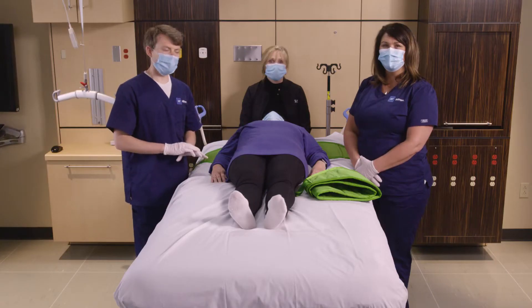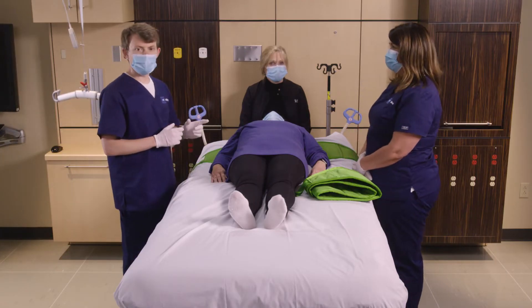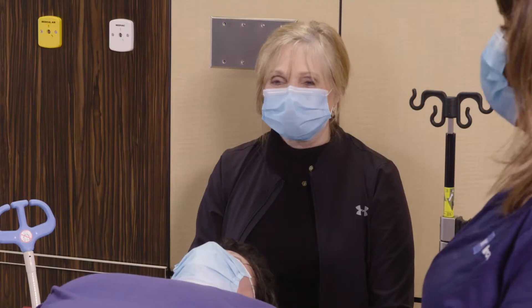Welcome to Hillrom's video on how to prone a patient using Leco multi-straps. To accomplish this we'll need three caregivers: one on each side of the patient and one at the head end to manage the airway.